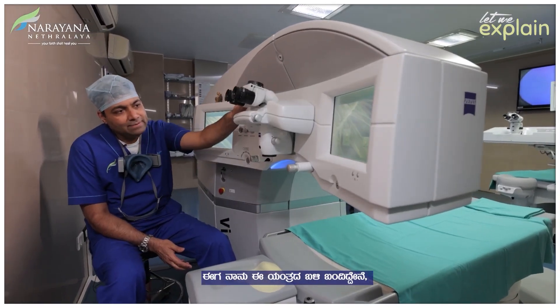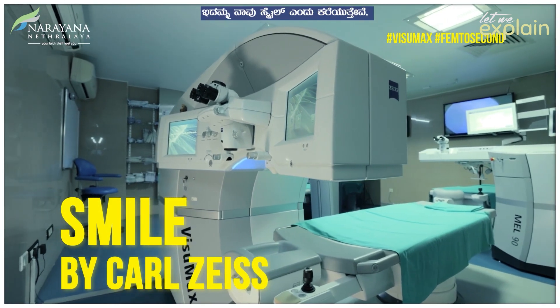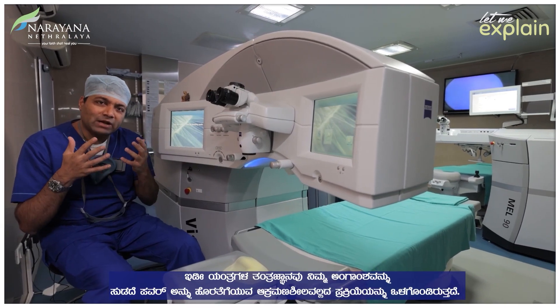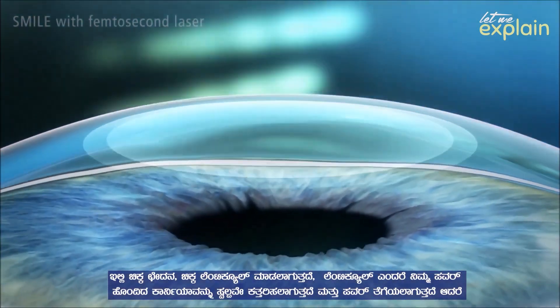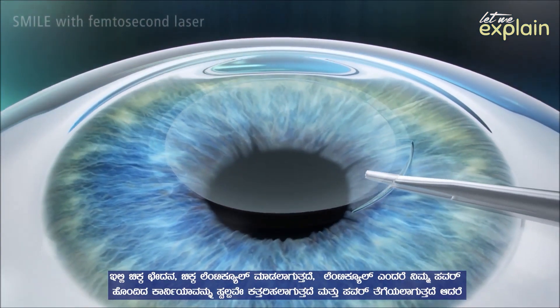Now I come to this machine. This is what we call a SMILE. The whole machine's technology involves a very non-invasive process of taking the power out without actually burning your tissue. It's a small incision — a small lenticule, we call it. A lenticule is nothing but a small part of the power of your cornea which is cut, not burnt, and taken off.